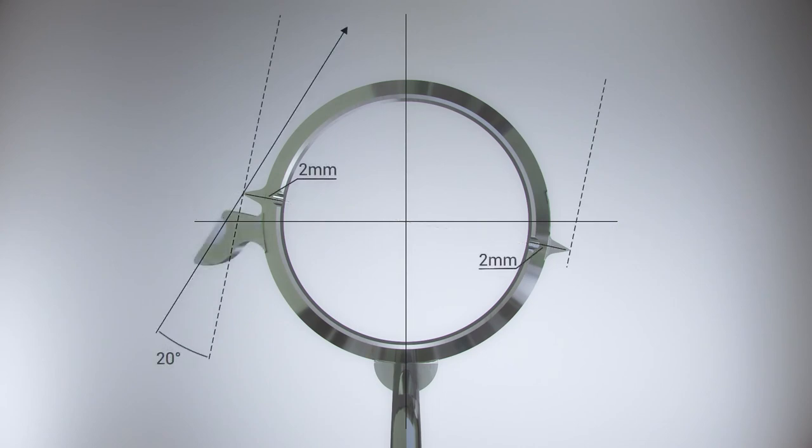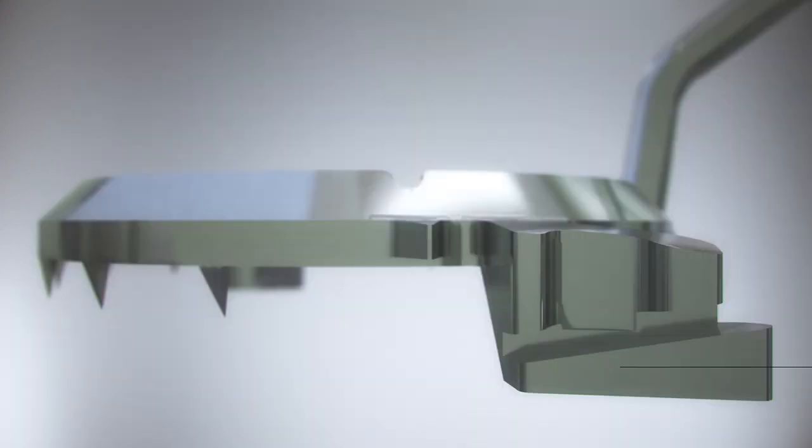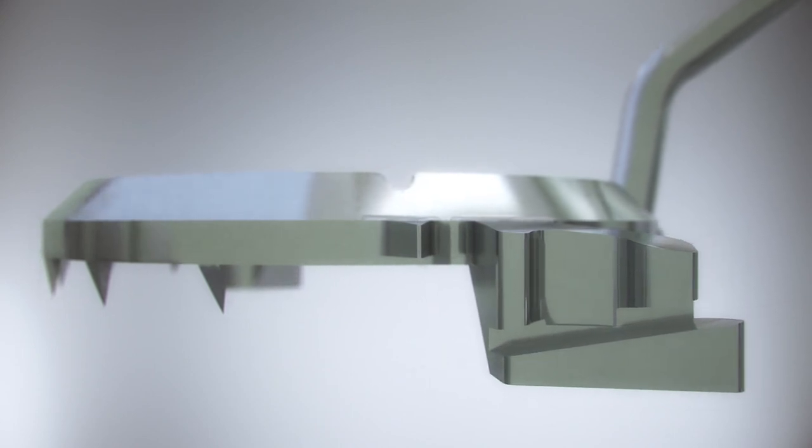The device comes with two wings having a groove for passing a needle through the ring-shaped body. By piercing the needle along the groove, it became possible to insert the needle at a set angle.